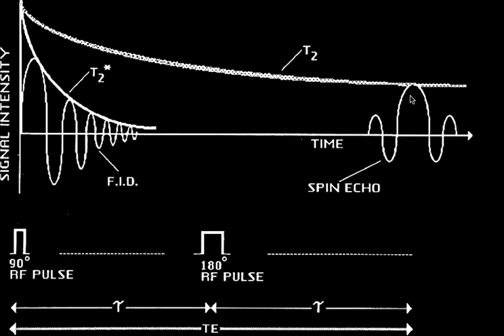And that's why the peak of the echo we get is different from being the maximum value. And that's why we can differentiate between tissues based upon T2, because some tissues have a lot of time varying magnetic fields and other tissues don't. And therefore it gives us great contrast for pathology.